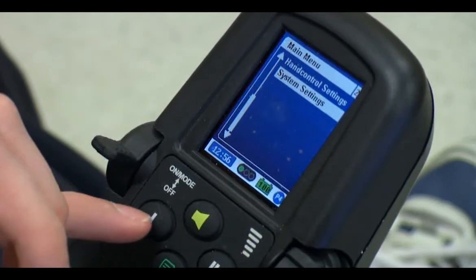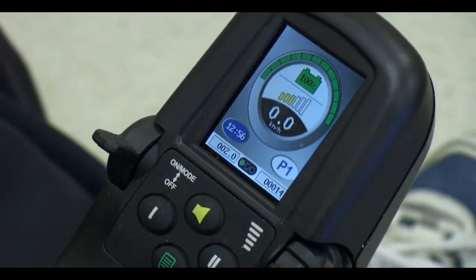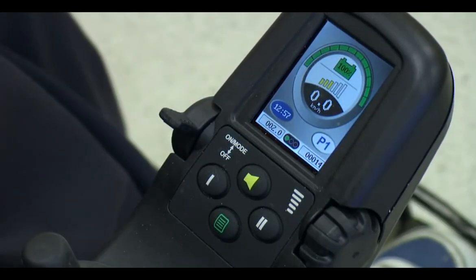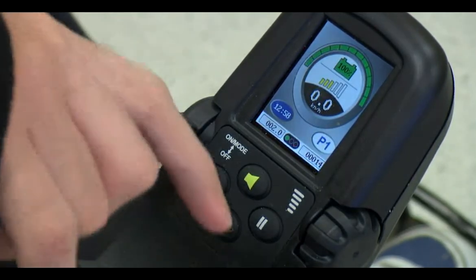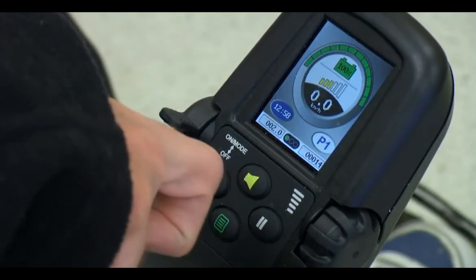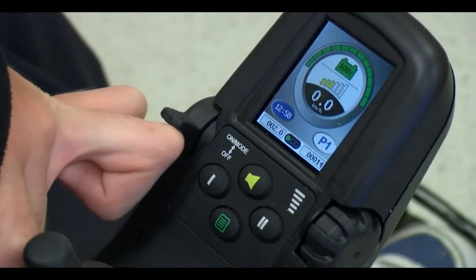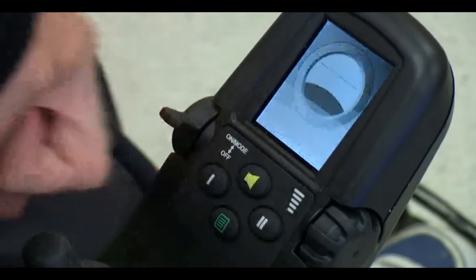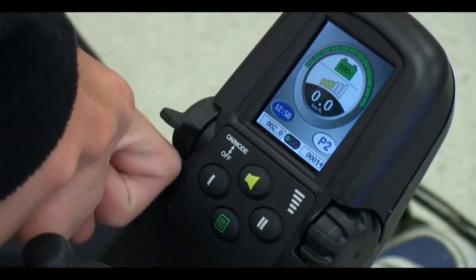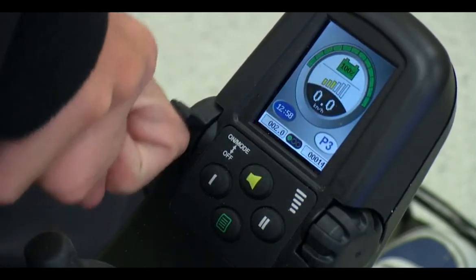That'll take it back to the main page. Now I'm going to show you how the footrests and the backrest work. As you can see I'm in program one. To change that, I just move this knob up — now I'm in program two, going up again, program three, and program four.